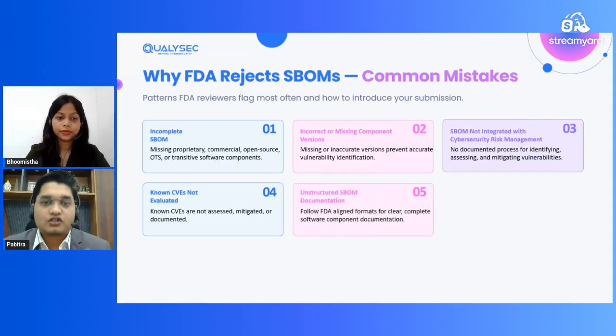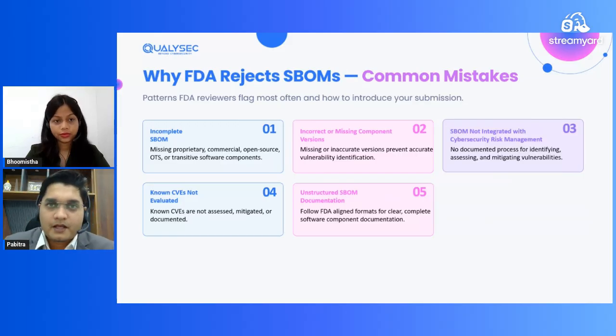Then unstructured SBOM documents are also a very common reason, because most of the time, what most manufacturers do is download an SBOM template from the internet or from AI, create the SBOM, and provide it. But think as a regulatory reviewer who reviews the document. If we follow an FDA aligned format, it will be easy for the regulatory bodies who are going to review our report. They're going to easily understand it.